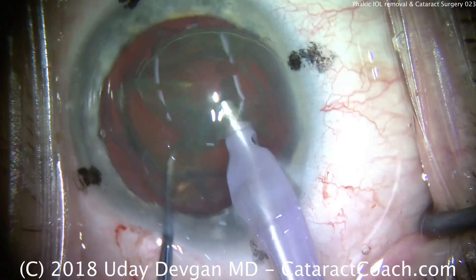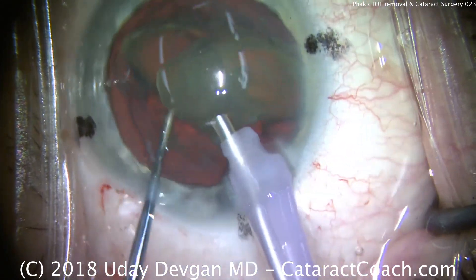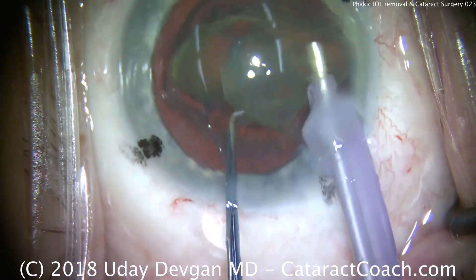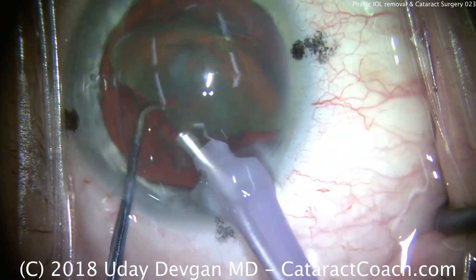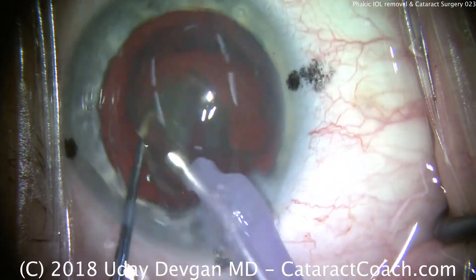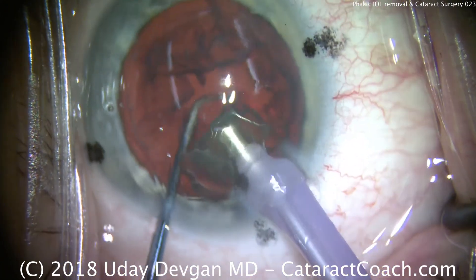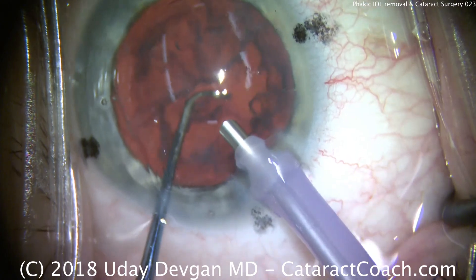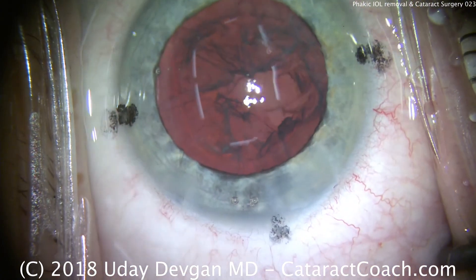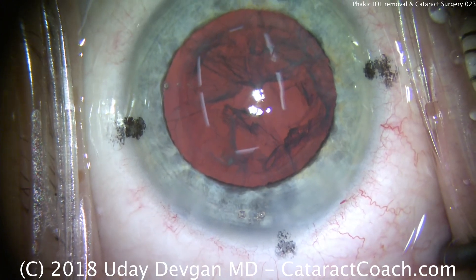There's a chop right down the middle and two halves. We'll emulsify the first half — really no need to further sub-chop this nucleus. The chopper's job now is to keep the nuclear pieces in front of the probe. Protect the posterior capsule. So we'll take out this cortex, maybe a little bit of an epinuclear shell, with the irrigation-aspiration probe.